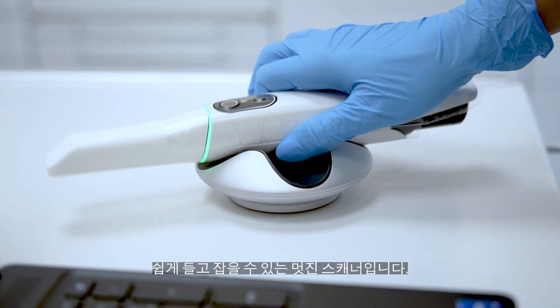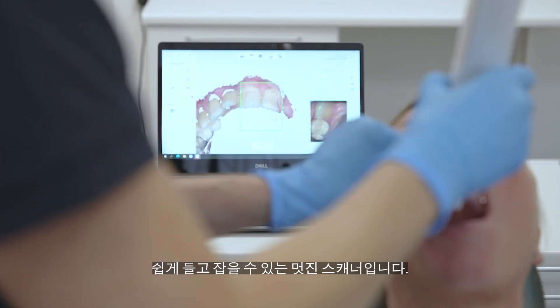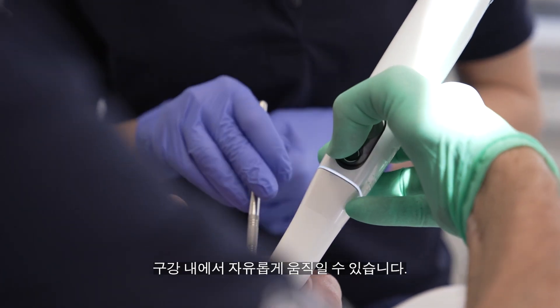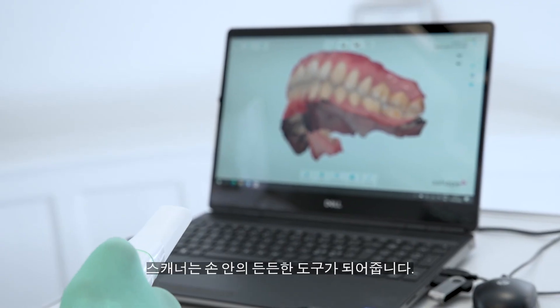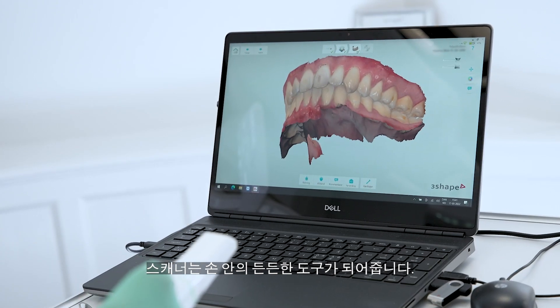It's easy to hold and it's easy to grab. It feels nice. I feel that it easily slides around the mouth. When I take the T5 in my hand, it kind of makes my day. It's a very nice instrument to have in your hand.